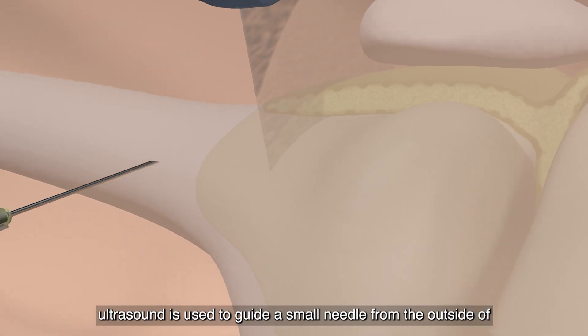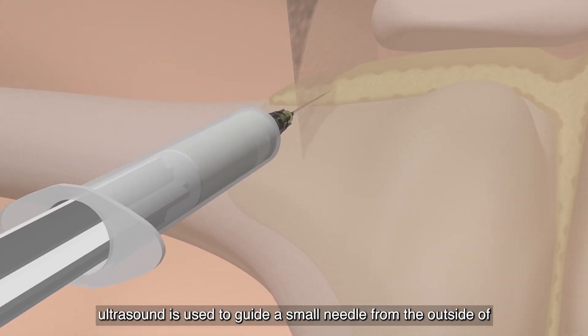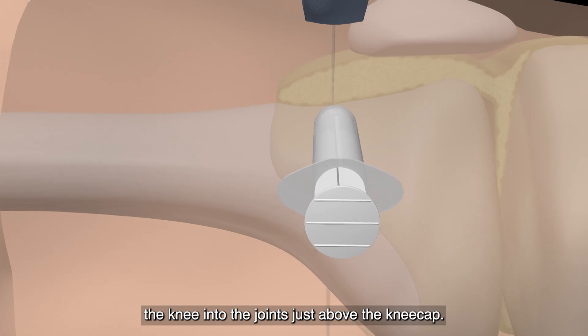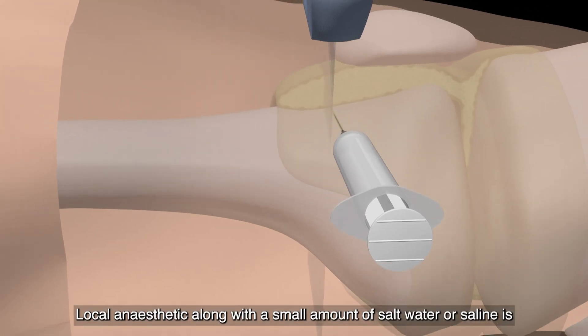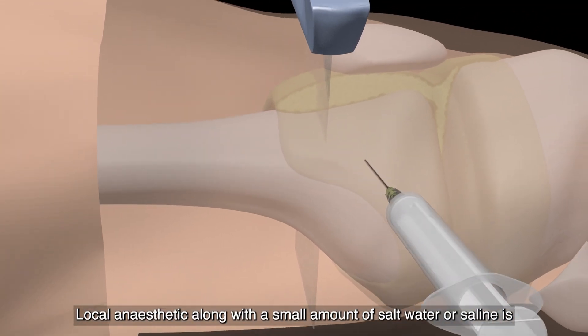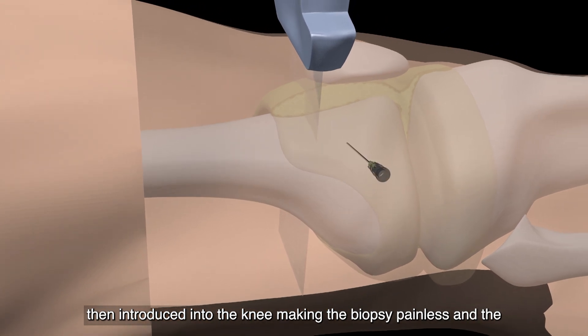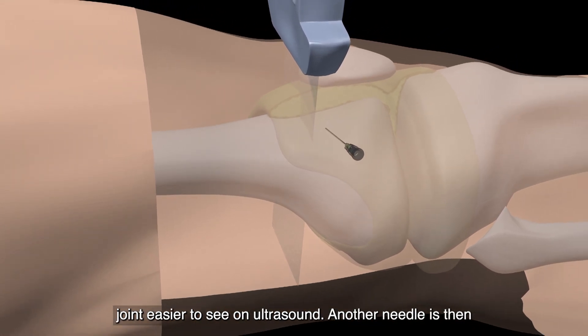During the procedure, ultrasound is used to guide a small needle from the outside of the knee into the joint just above the kneecap. Local anaesthetic, along with a small amount of salt water or saline, is then introduced into the knee, making the biopsy painless and the joint easier to see on ultrasound.